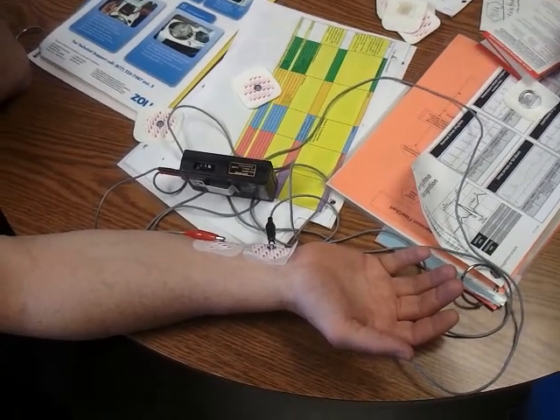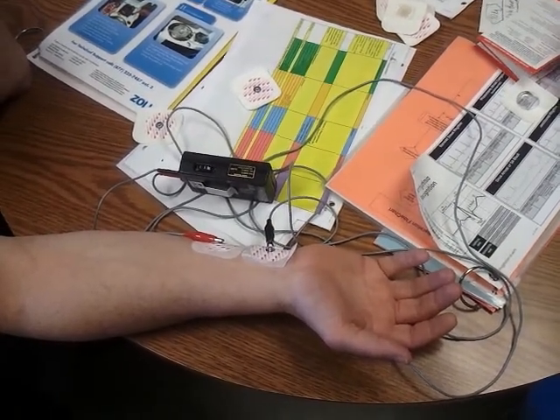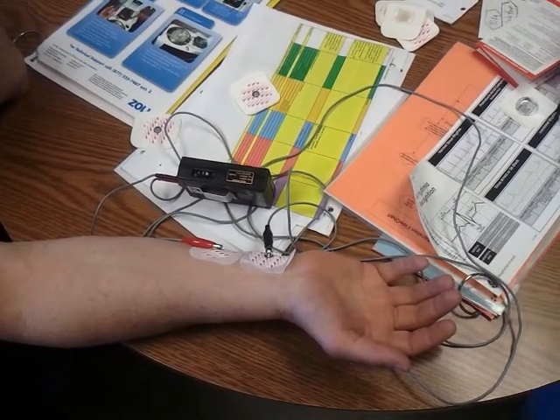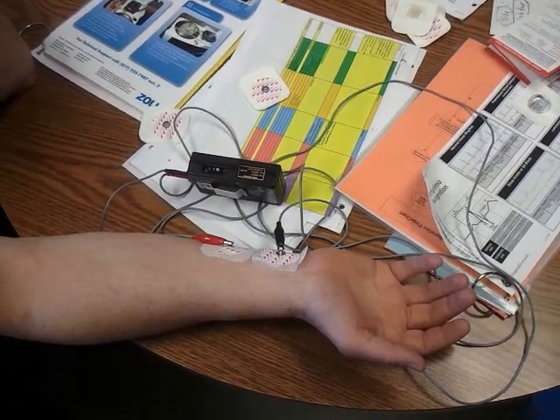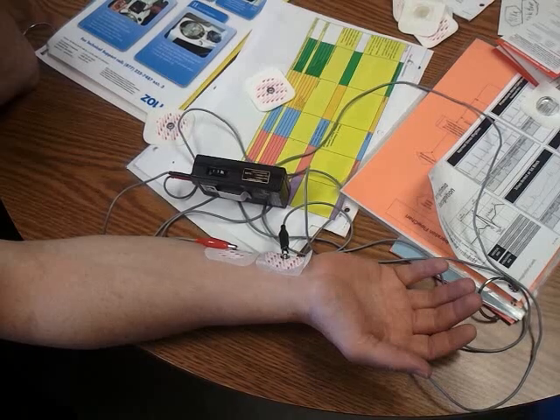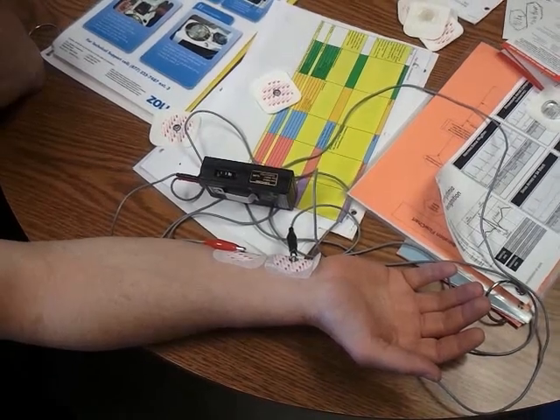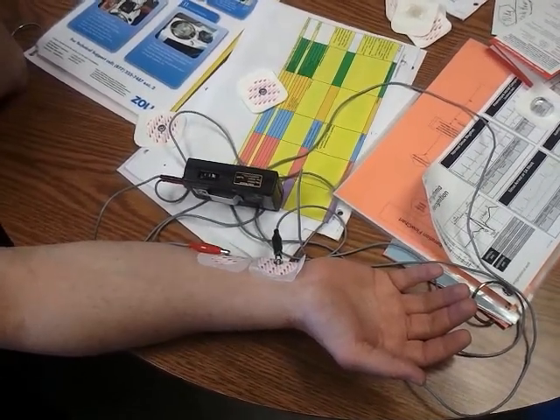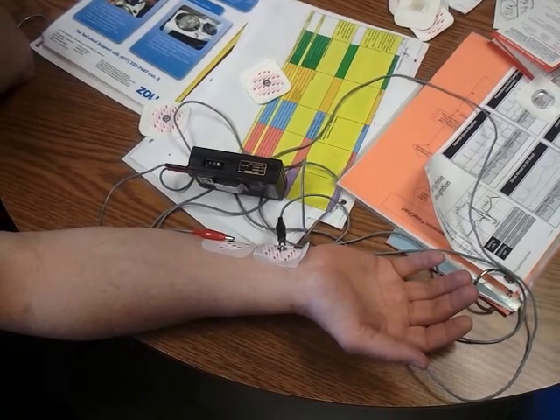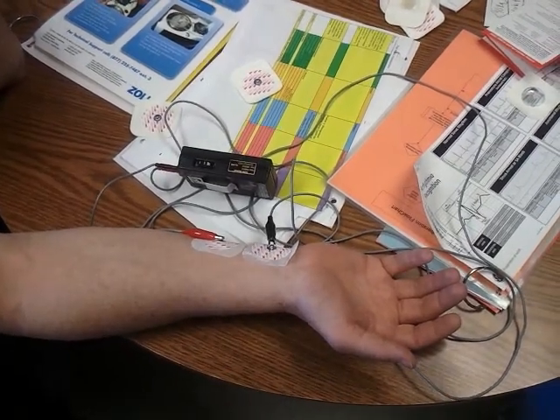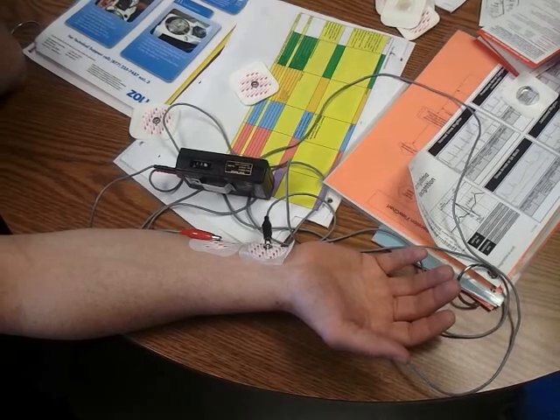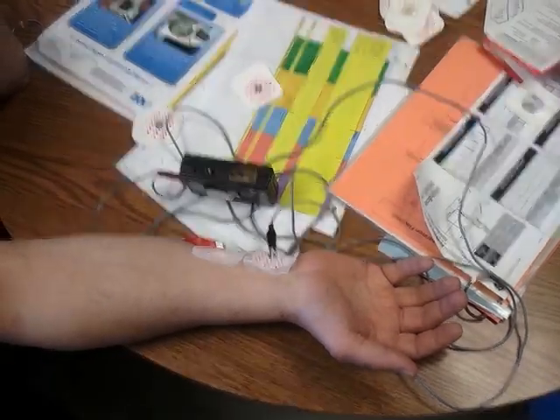So when we do this to test that we have enough sedation, we want to see, it all depends on what the doctor orders. Maybe one twitch, two twitch. It's usually around that one to two twitch range. And then we know that they've been paralyzed enough. No twitches at that level five means he's probably over paralyzed. Okay. Alright. Go ahead.